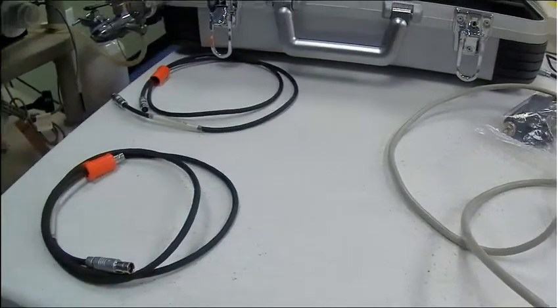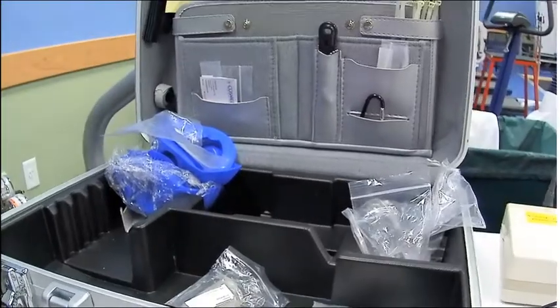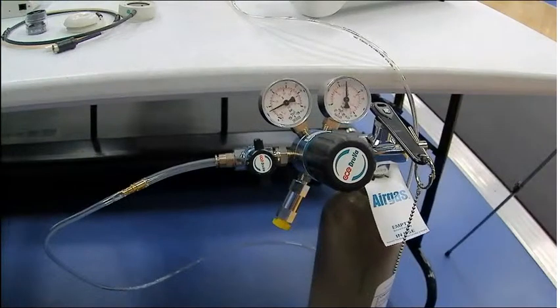To the left here, we've got two battery adapters, and here's the briefcase it all comes in. The manual's up in there. Here we've got the gas calibration tank.